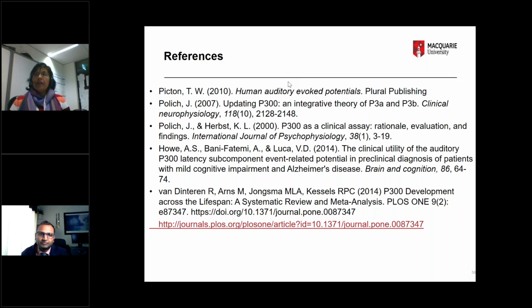So, yes, it is tangential, that's for sure. But like Gary Rance's work pointed out about the cortical responses, for P300 to happen, first there needs to be a cortical response. As we know, there is a percentage of neuropathy cases where we don't see cortical responses. So trying to do P300 there, that question doesn't arise, right? But for the remaining, if they're able to attend and we can do a P300, I think this would be exciting to do, because then we can figure out about their discrimination.